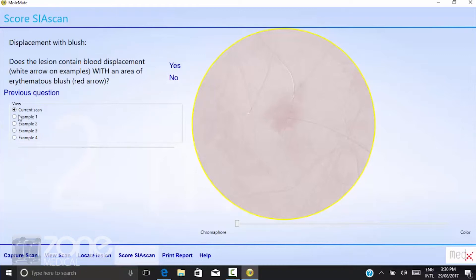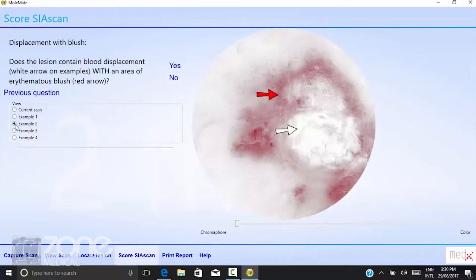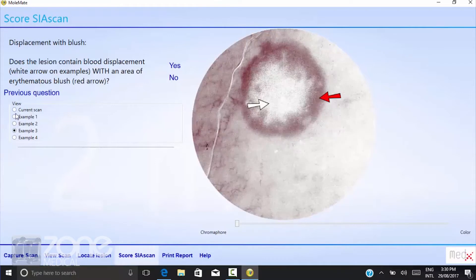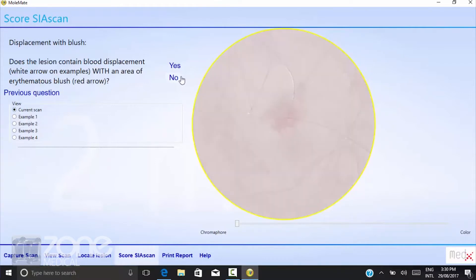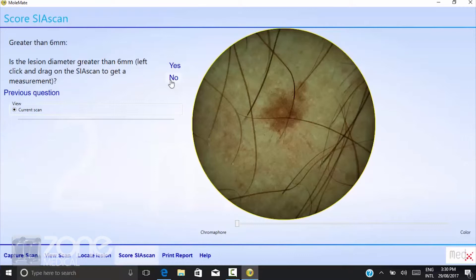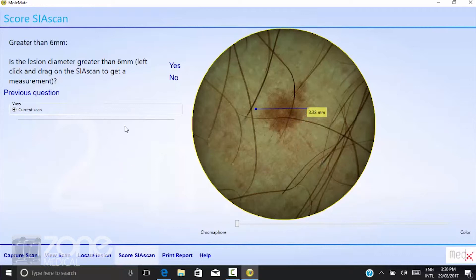Just follow the prompts — they'll give you samples of what you're looking for. The last question will actually ask you to measure the scan. In this case it's 3.38 millimetres, which is less than six millimetres, so the answer is no, it is not greater than six millimetres.